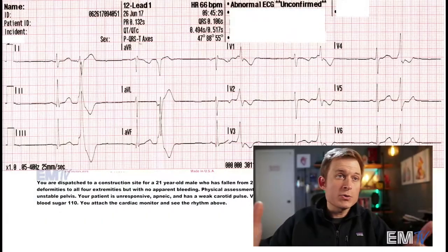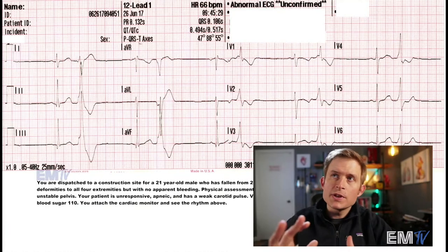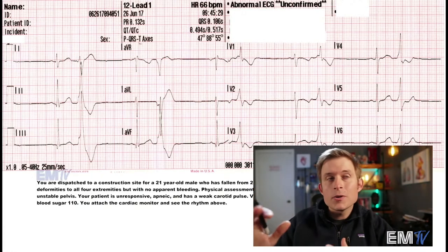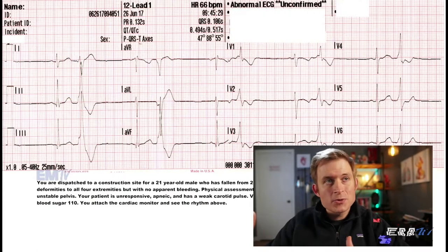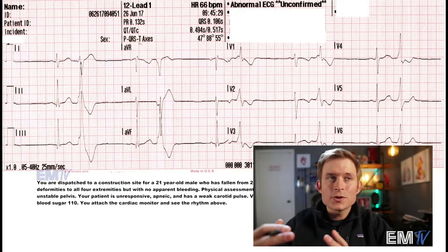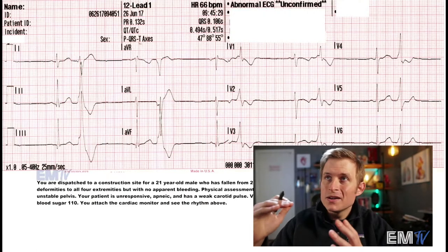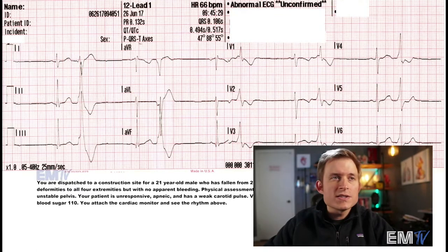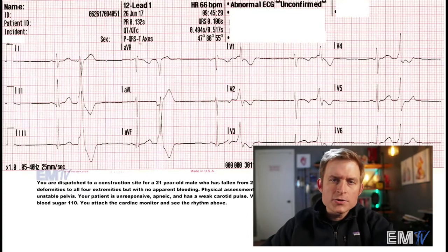So for this card you're given a 12-lead, and unlike my other videos this is actually a LifePak or a monitor-style 12-lead, not a hospital kind, so you don't get that expanded single lead view on the very bottom. So let's take a look at this a little more closely and see if we can determine what this rhythm actually is.